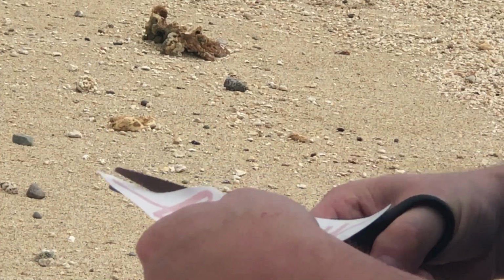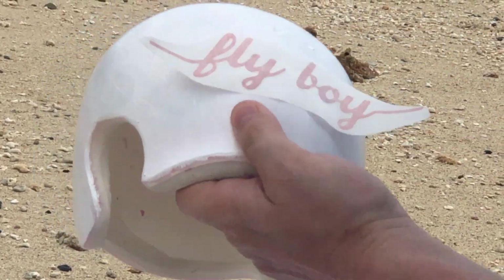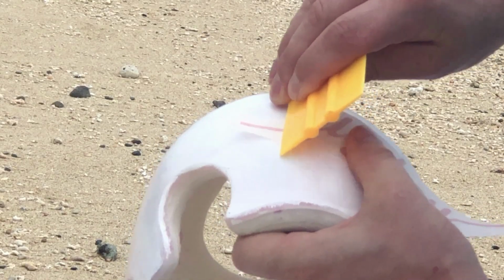This flyboy element is large, but applying it won't be too hard if I just focus on getting the vinyl down flat and let any creases build up in the transfer tape.